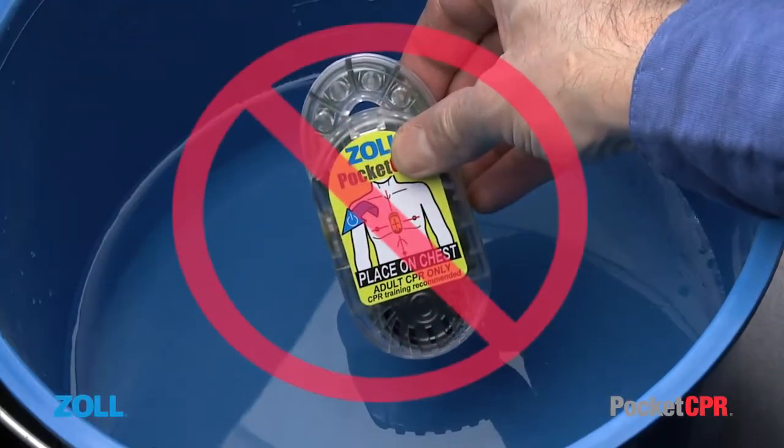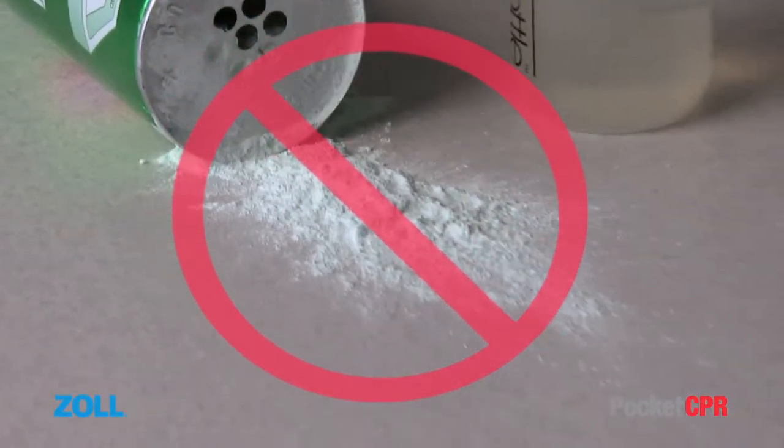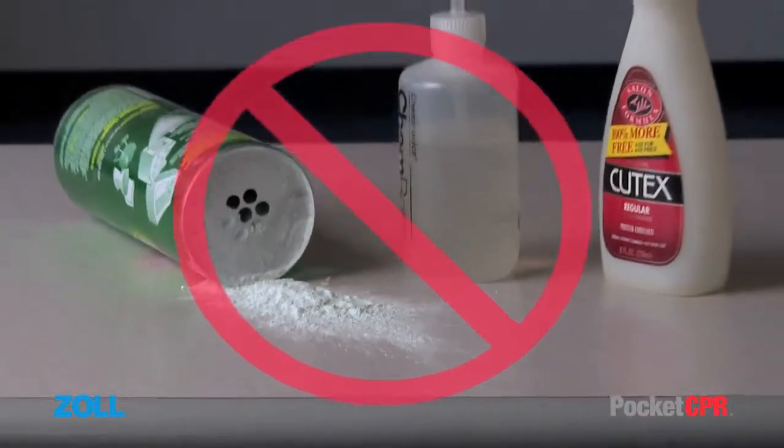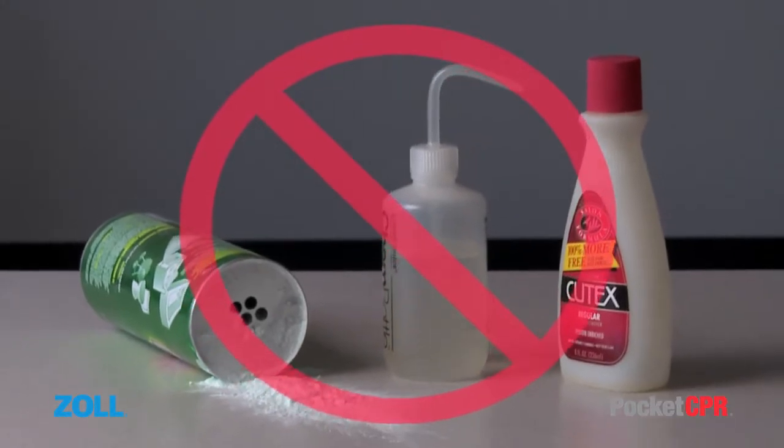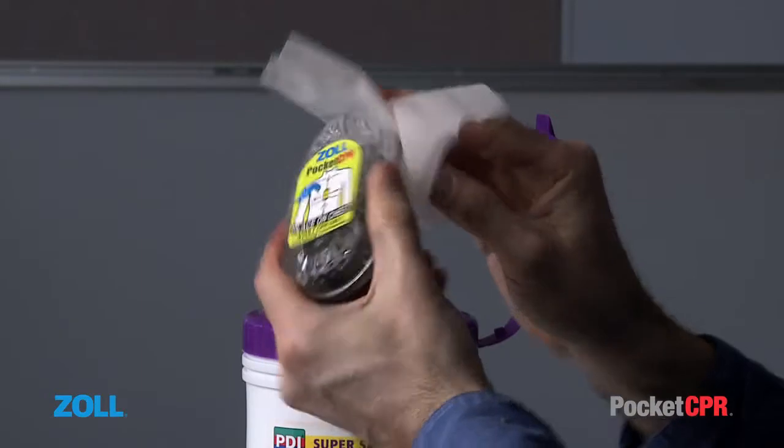Never immerse the unit in water. Never use abrasive chemicals. Never use ketones such as acetone. Do not sterilize the device with any kind of machinery. Just mild soap and water and a soft cloth.